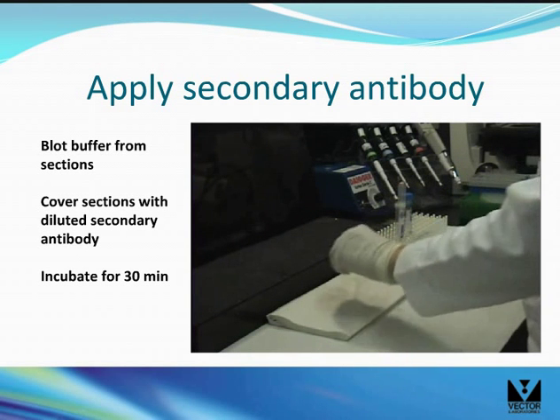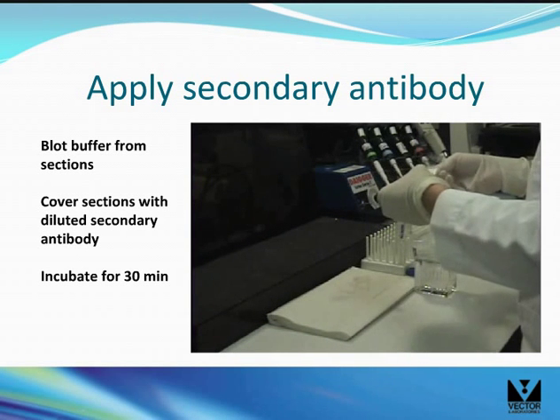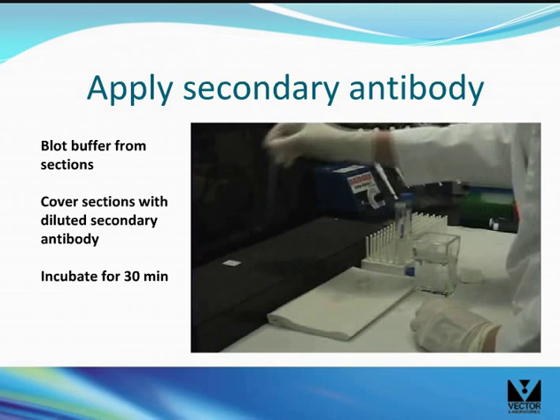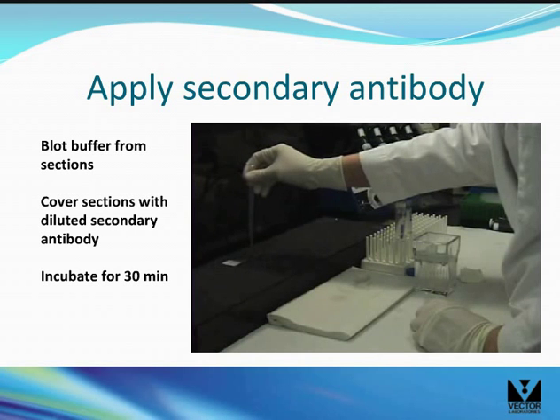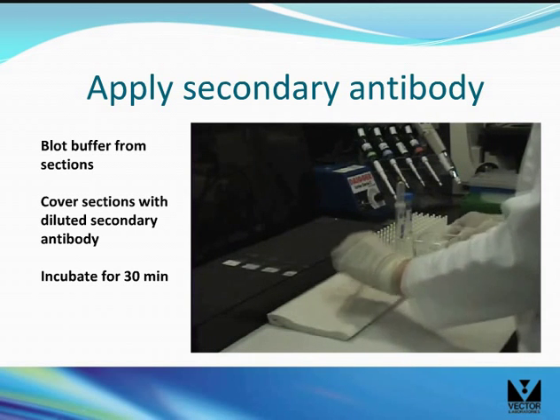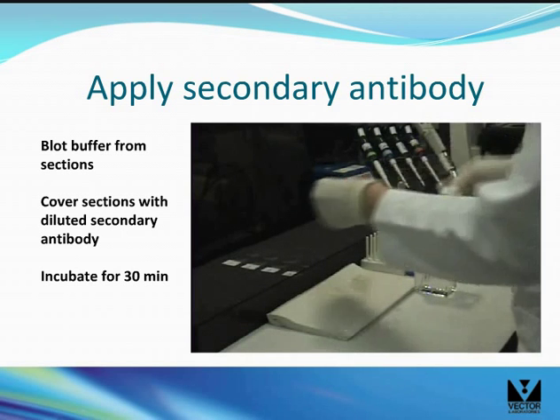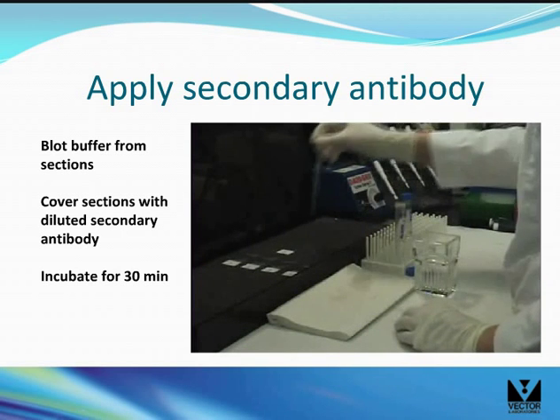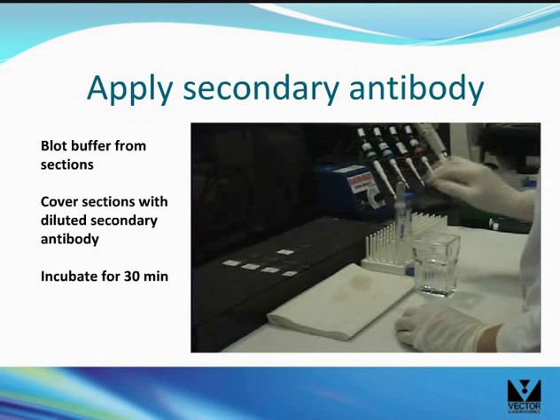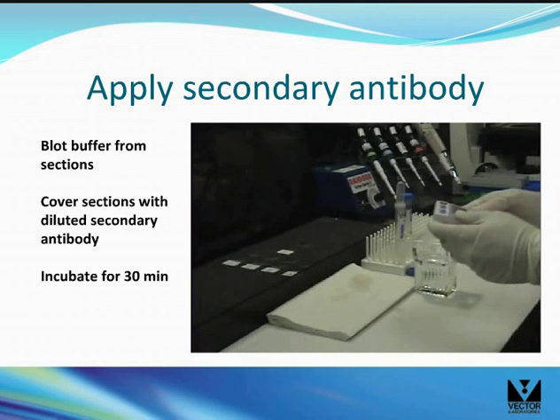Blot the buffer from the sections as shown. Cover the sections with diluted secondary antibody solution — usually 100 µL is sufficient. Incubate for 30 minutes.